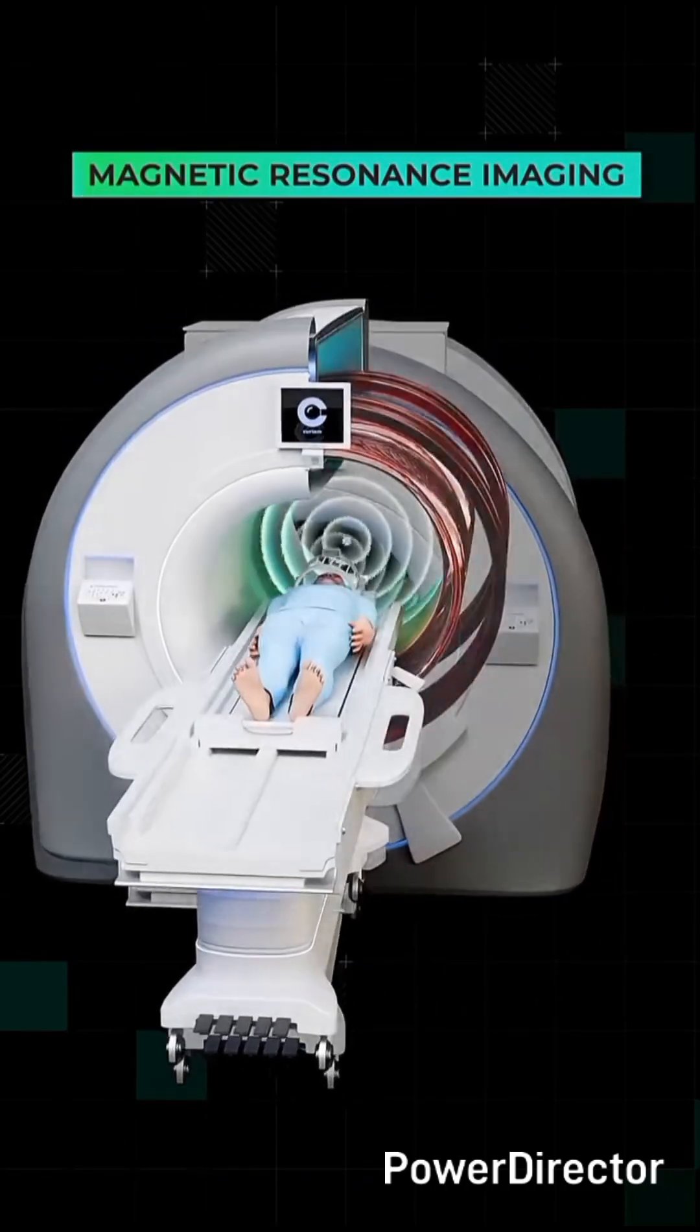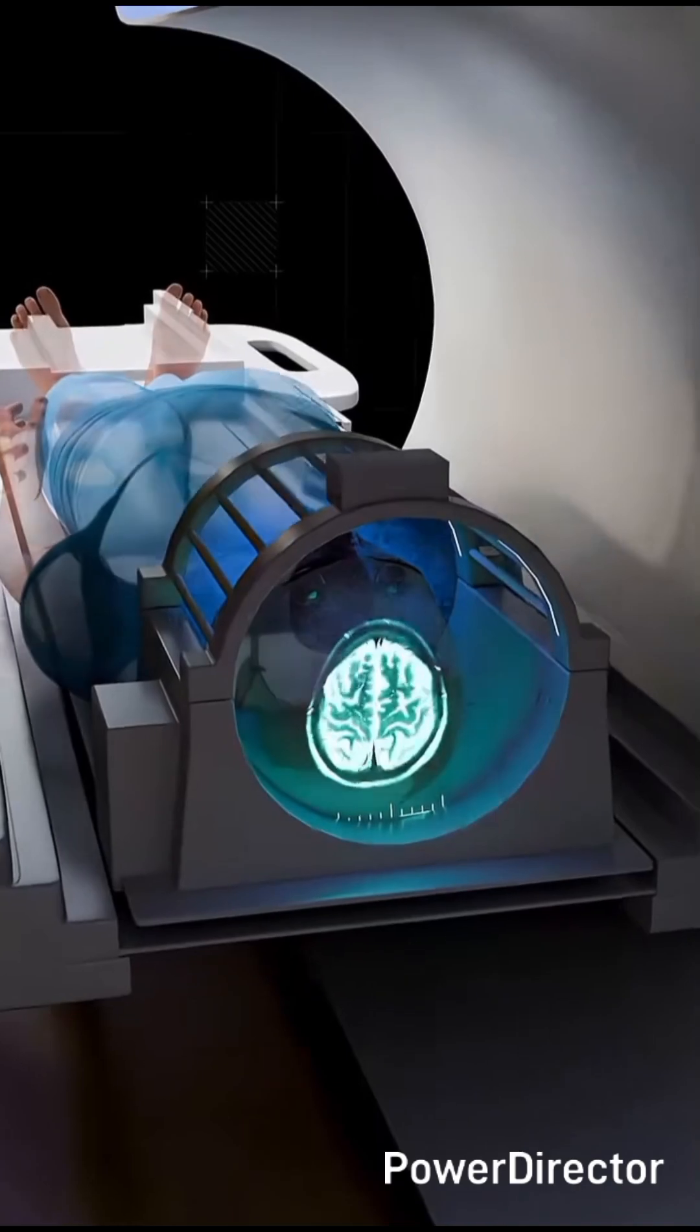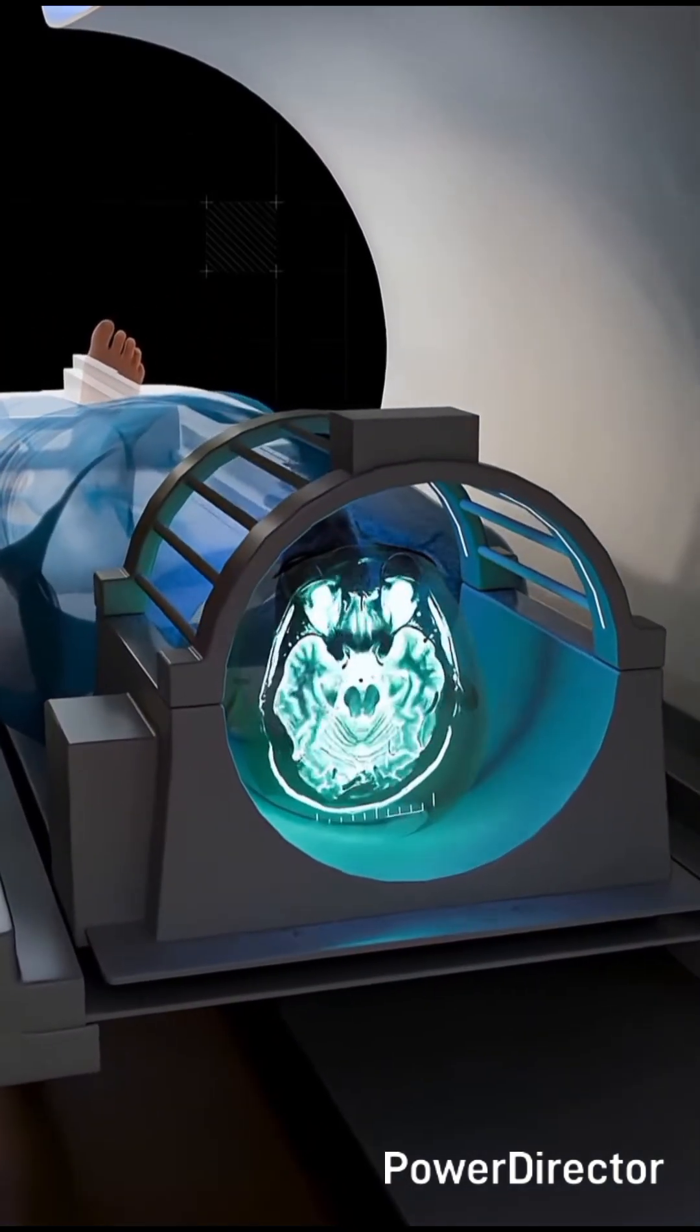An MRI machine is one of the most complicated and marvelous pieces of engineering. It can give you a detailed 3D image of your body's insides.